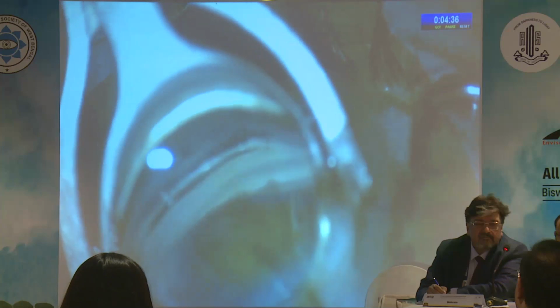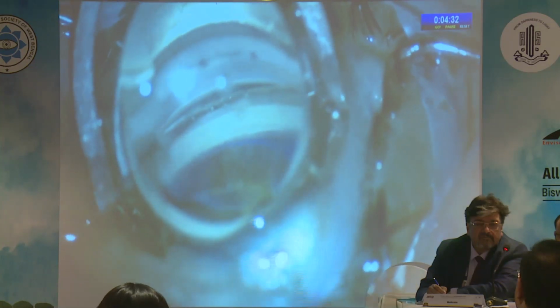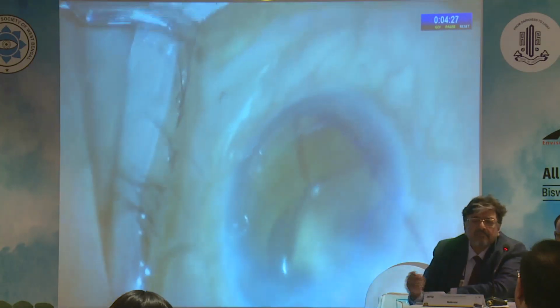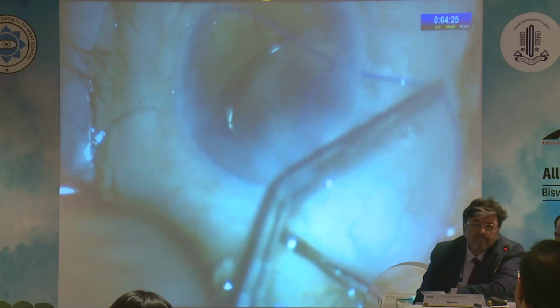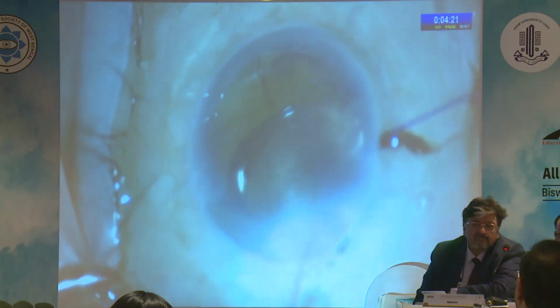After 20 to 25 passes, the mushroom tip appears on the other end, the cleft. By holding the mushroom tip, the proximal end of the suture is gently pulled all around 360 degrees in anti-clockwise direction to excise the trabecular meshwork for a successful GAT.